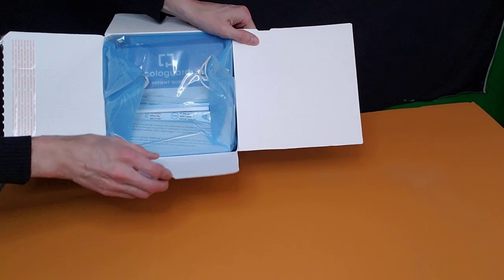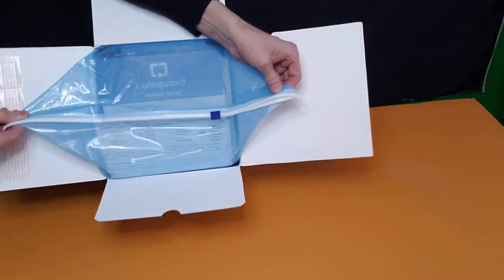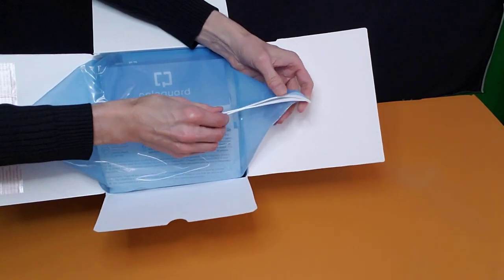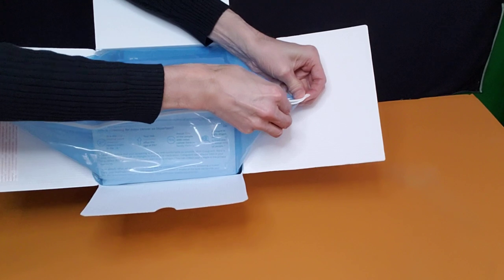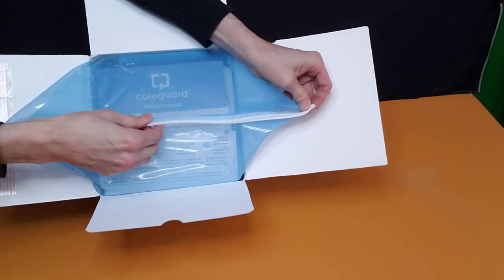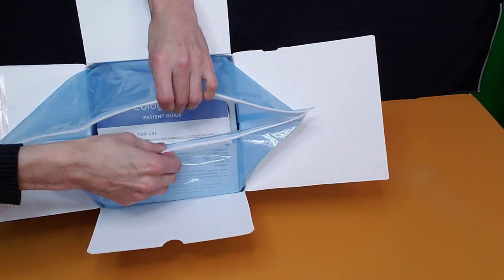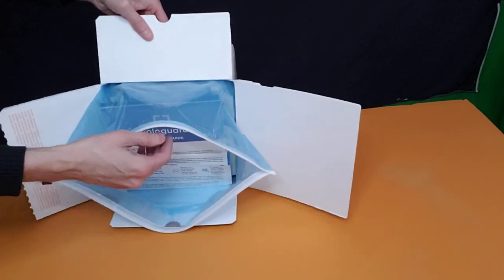Inside the box you have this plastic bag. Let me turn it sideways so you can kind of see.